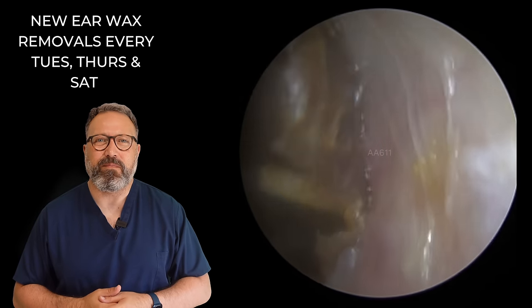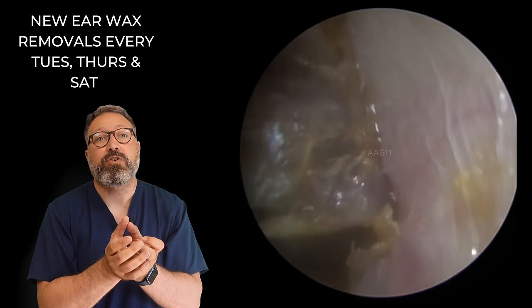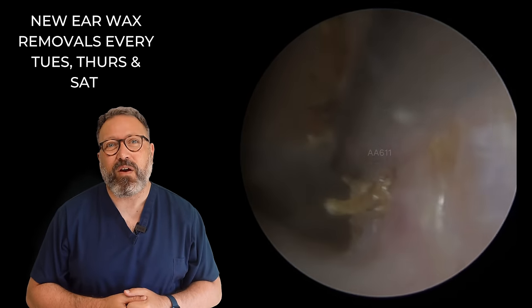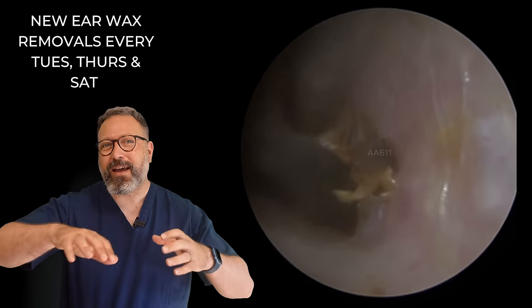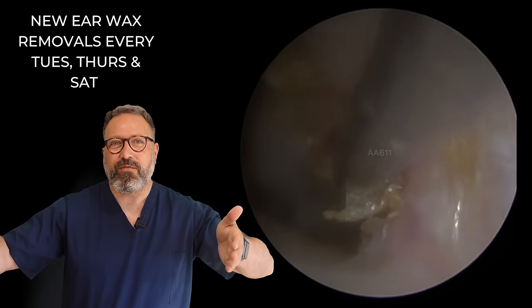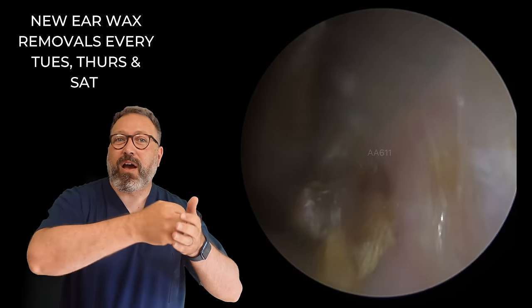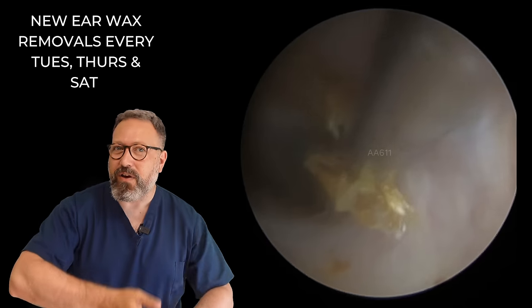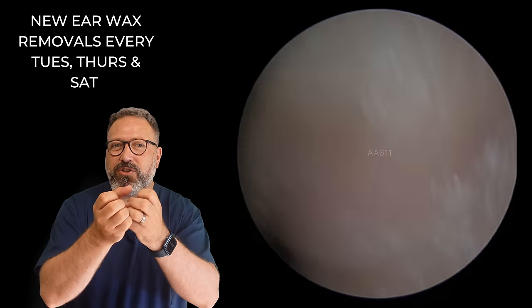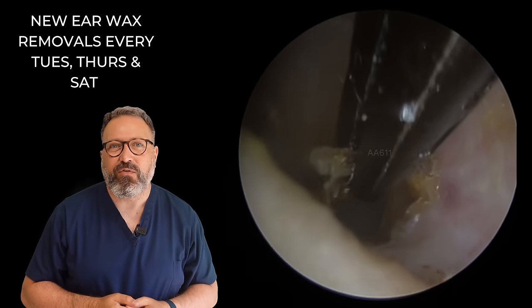That's what's been anchoring everything into place and drying that outer section of wax as well. I'm starting to fold it over — I'm running out of room, because when you're peeling, you want plenty of room to peel away from the surface. The difficulty here is that we're in a quite narrow part of the canal. I've got it as far as I can one way, so now I'm going to have to shear it — hold on, bunch all that looser skin into the suction tube and pull downwards to try and shear it. But it's not really budging, so we're going to bring the crocodile forceps back in — great for skin.